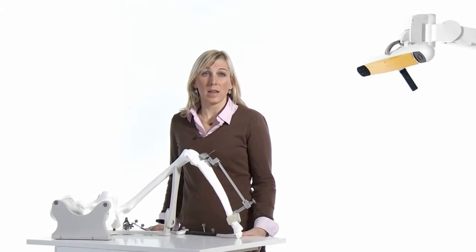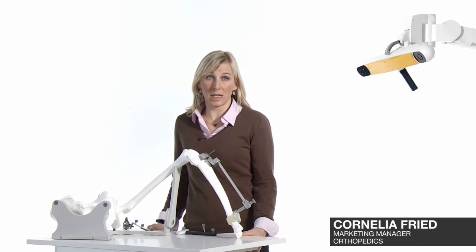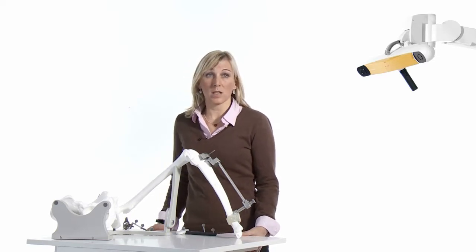BrainLabs knee express software is a fast and easy tool to verify the cutting block position during knee replacement surgery without any additional pins. You can follow your standard procedure and use conventional instrumentation, and the software will provide accurate information on alignment.